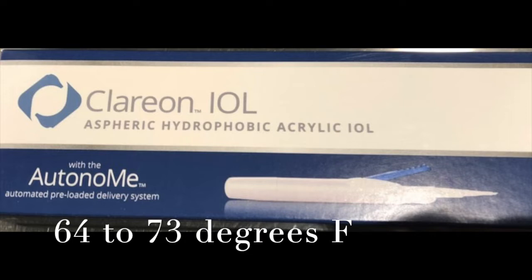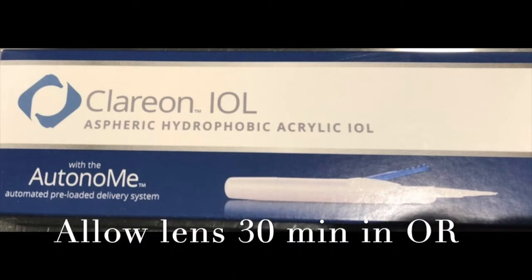The key is to store the lens between 64 and 73 degrees Fahrenheit and to also allow the lens 30 minutes to warm up in the OR prior to insertion inside of the eye. This allows the lens to be more pliable and bend properly as it comes down the cartridge towards the tip.